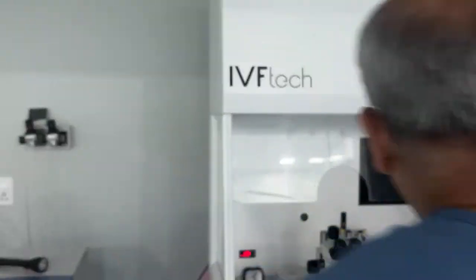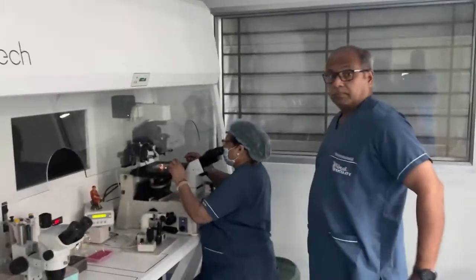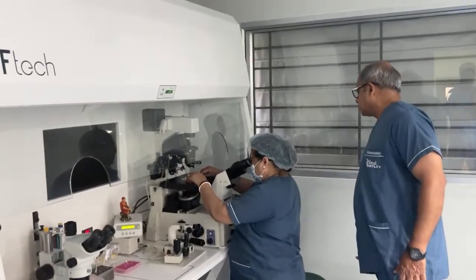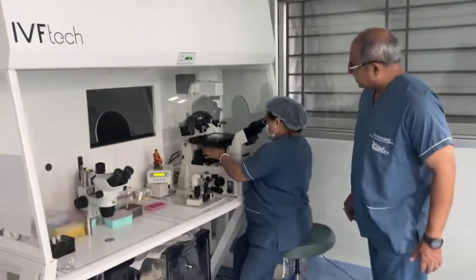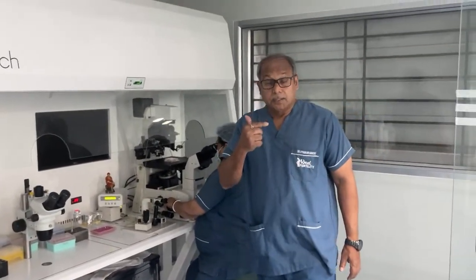And now she is putting one blastocyst inside the microscope. It is on. I will show how it looks when it goes into the OR1 system. Can we go there?